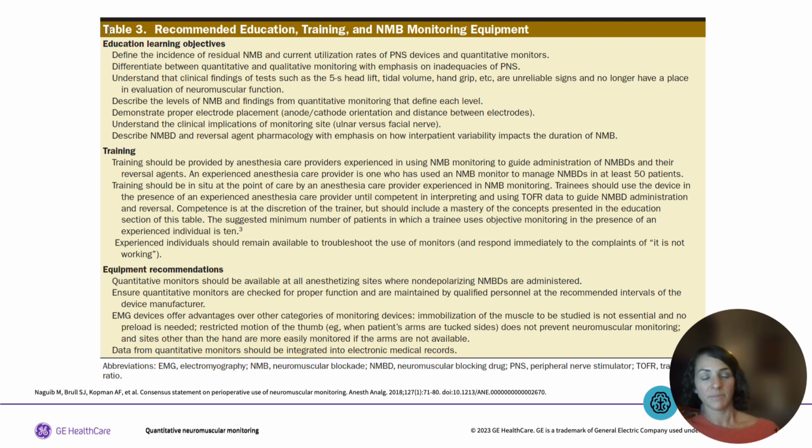And because Sugammadex has been very beneficial from this perspective, it allows for an immediate recovery of symptoms. You administer a small dose of Sugammadex, the train of four ratio jumps up to 95-100%, and there's complete resolution of symptoms. And that's really what it took in a lot of scenarios with those people who were just slow adopters. They had to see it to believe it.